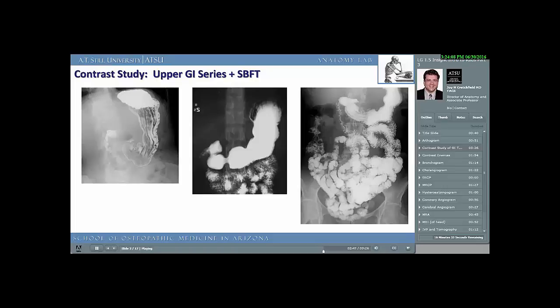The opposite is true in the abdominal cavity. In the abdominal cavity, gastrographin is considered quite safe and barium is considered just the opposite. Keep this in mind in your training. Contrast studies are very commonly used and continue to be used today. They still offer a significant amount of information and often have a therapeutic as well as a diagnostic purpose. For example, a gastrographin enema can cause diarrhea, which may be the intended result if the patient suffers from a colon blockage or severe constipation. You'll see a lot of these studies as you progress through your training.